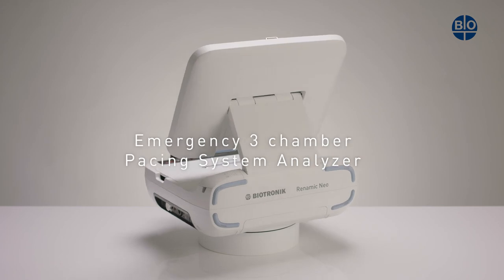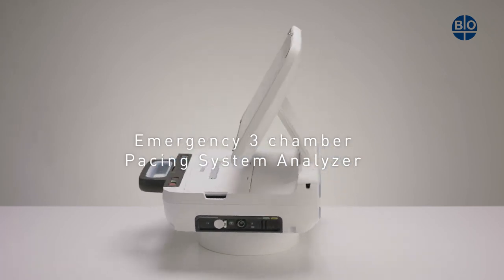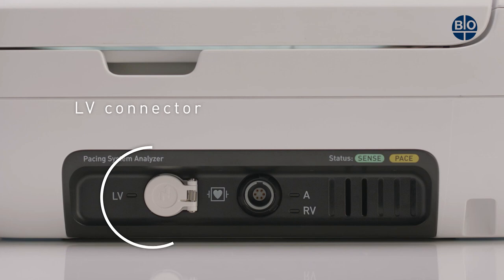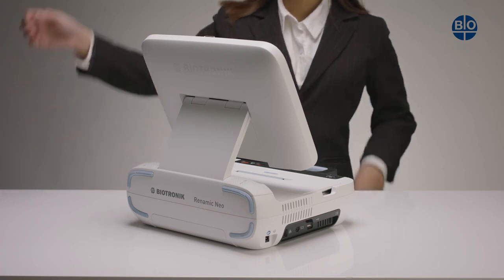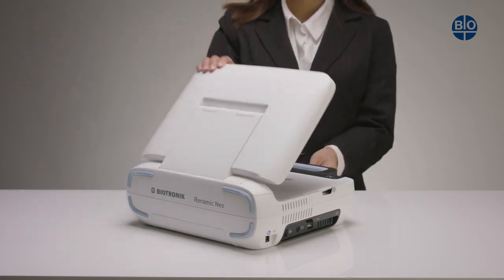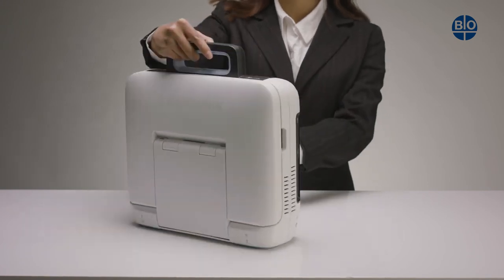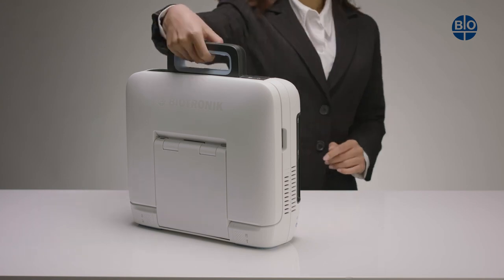A three-chamber pacing system analyzer is integrated into every RENOMIC NEO. The ARV connector allows atrial or right ventricular measurements, and the LV connector is for left ventricular measurements. Once you have completed your measurements and stored the cables away, power down the device and then close the screen. The handle should always be used to carry the device, and it can be placed in a standard luggage case for transportation.